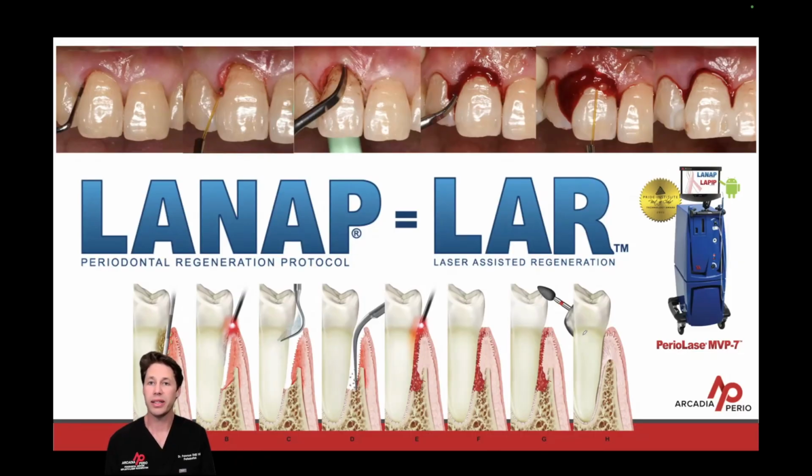So now I want to highlight the LANAP protocol. And again, I want to highlight the difference between LANAP and laser assisted regeneration. Laser assisted regeneration is the LANAP protocol using the PeriLase MVP7 laser to site specific areas, and LANAP is a full mouth disease protocol. Let's walk you through the protocol step by step to highlight a couple of important details.